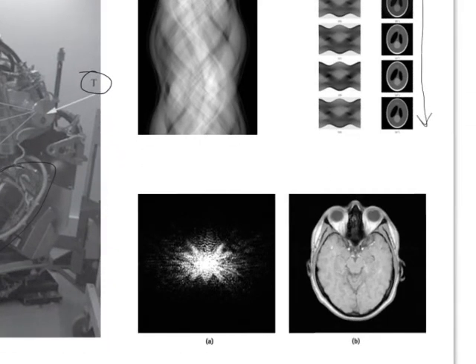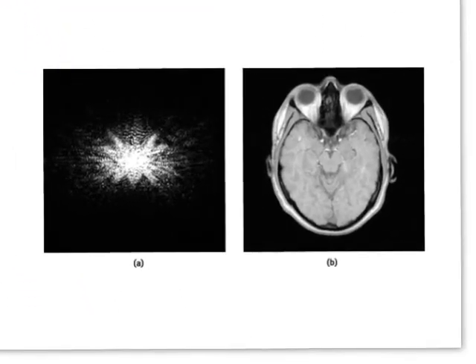Okay, here's another way to think about the raw data, because I talked about how in the world of the CT computer, the sinogram gives us a way to talk about spatial representation. If we talk about kernels or K-space, now we're talking about Fourier transforms. I'm not trying to talk over your head. This is kind of computery stuff that we'll dig into more deeply next trimester when we do the CT class. But I want you to be familiar with this, because you probably do this every day on your cellular phone if you ever edit a photo with your Photos app.